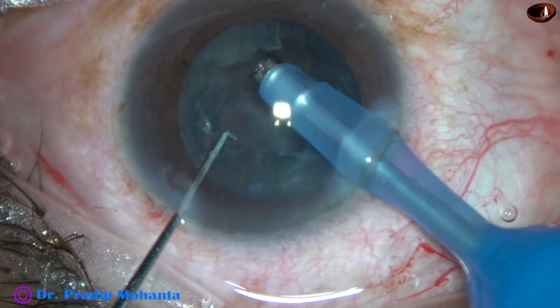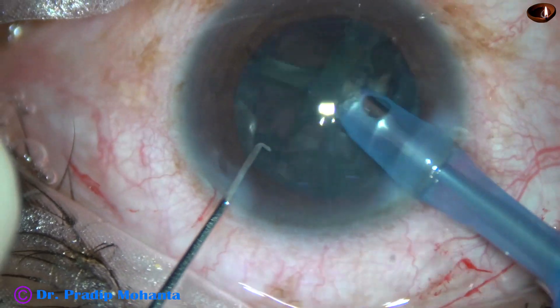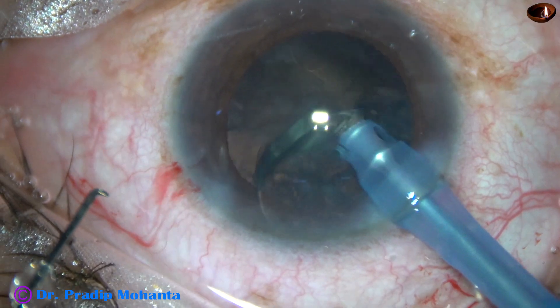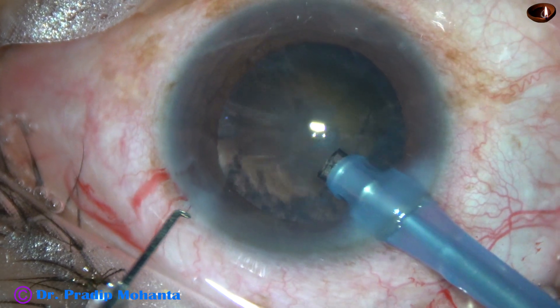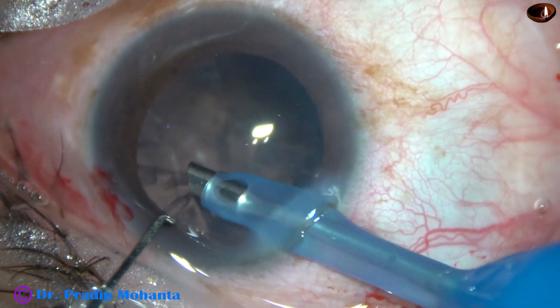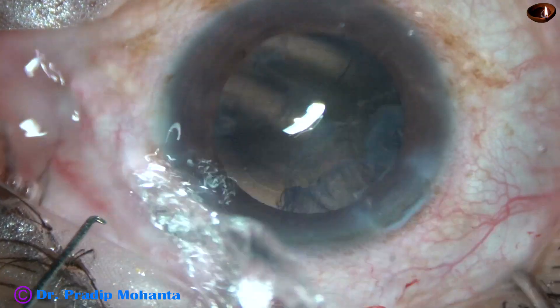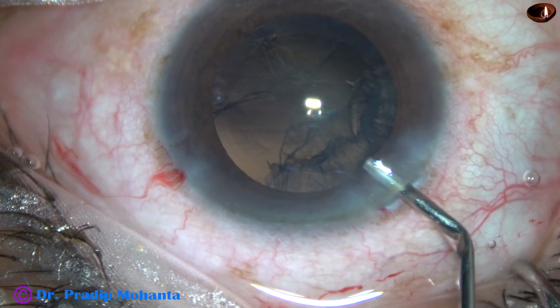Now the epinucleus shell is thick — it has to be mobilized very carefully. Posterior capsule rupture may occur if you go posteriorly to hold the epinucleus. So always remain anteriorly, just at the level of the anterior capsular rim. The epinucleus is removed, and a portion of the cortex has also been removed by the phaco needle.